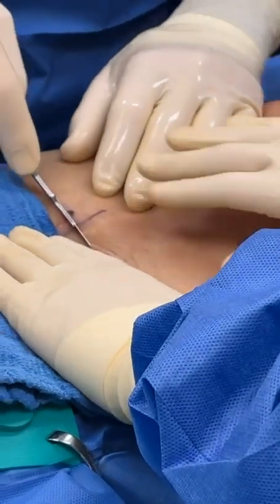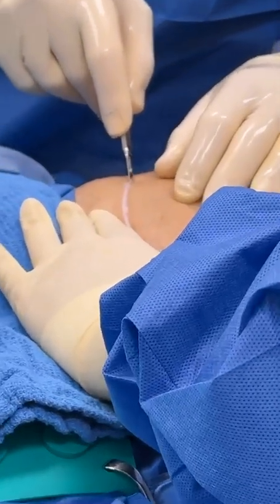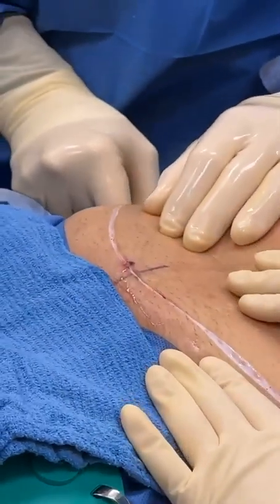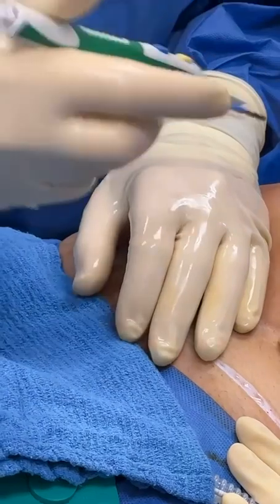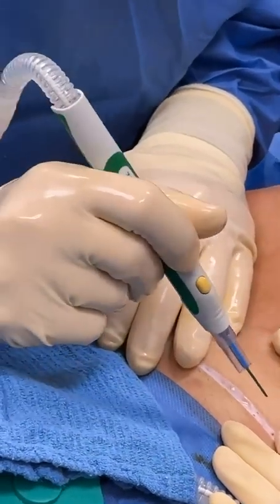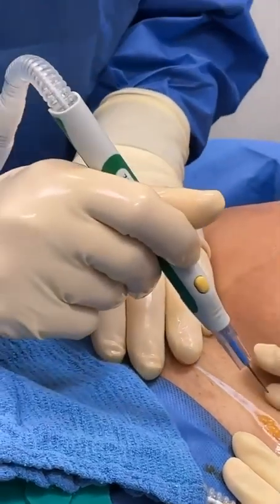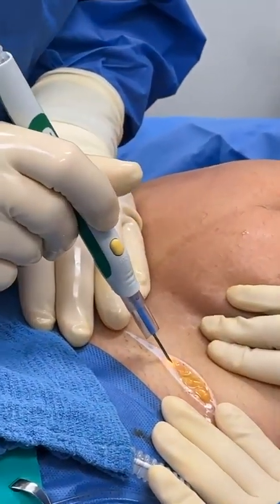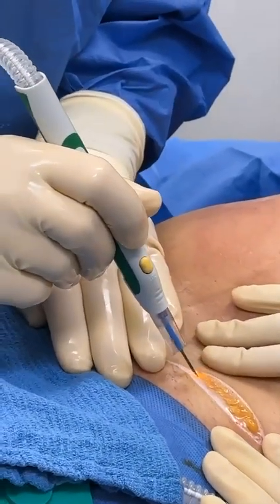What are we doing, Gabby? An extended tummy tuck. We're doing an extended tummy tuck, and what do you see, Elena? I see white. Yeah, that's no blood. Yeah, it's a superficial incision. You know, that white part is the dermis of the skin, and we do it on purpose because if I go deep through all this fat with the knife, then there will be significant bleeding. This will not be yellow, it will be red, right?